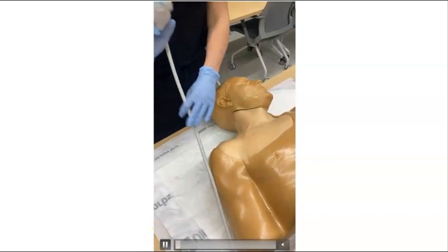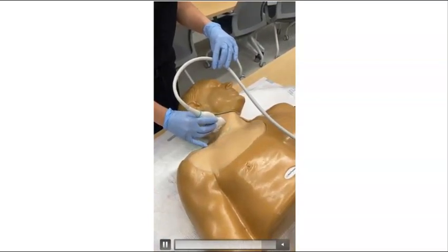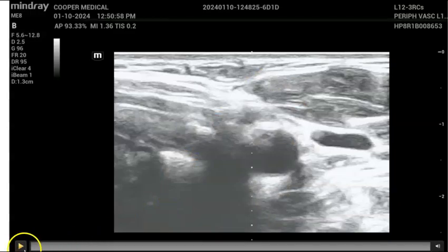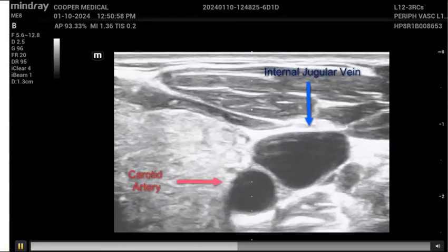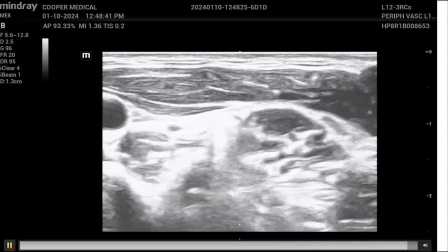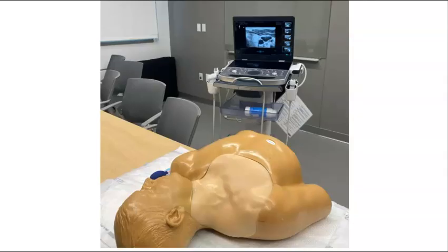Next, we want to look at our patient's anatomy and find the best location for a central line to be placed. We will start by using the linear probe and scanning up and down the neck looking for the internal jugular vein and the carotid artery. You can see the carotid artery on screen left and the internal jugular vein on screen right. We want our central line to be in the vein and not the artery. We can confirm where the vein is by using light compression and observing which vessel collapses. This is also a good time to find the best spot on the neck — where the internal jugular is the largest and furthest away from the carotid artery. We will not want to place our catheter where the vein is directly on top of the carotid artery.